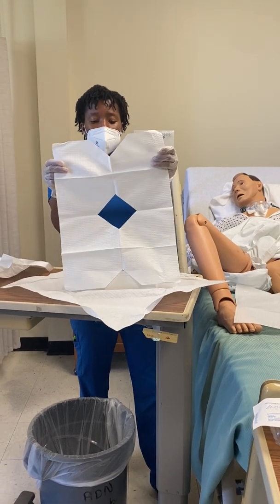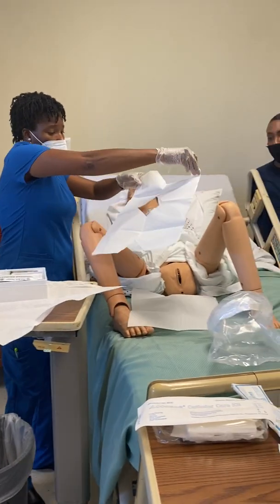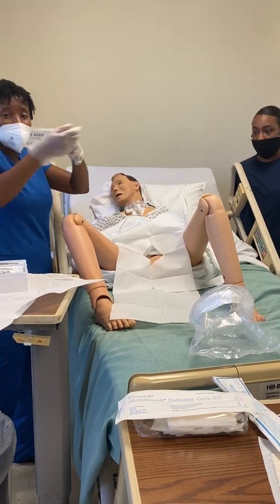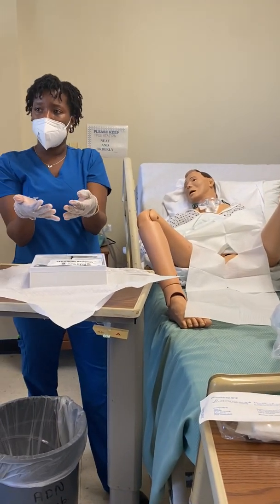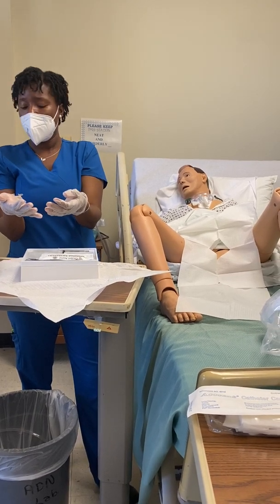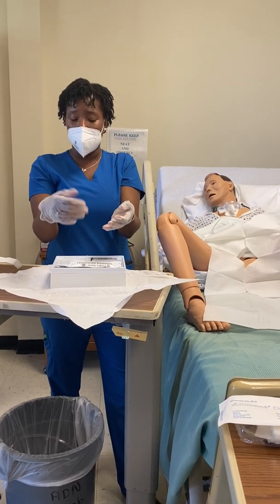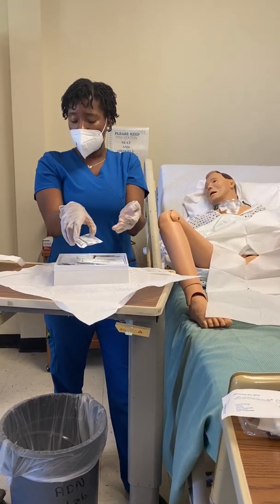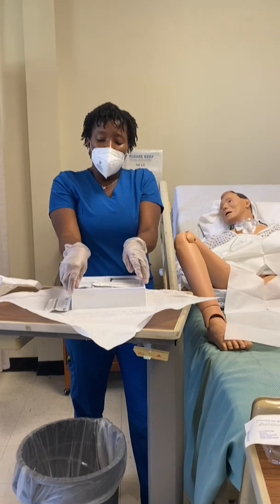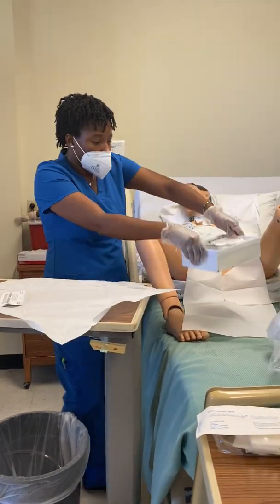Now this is the other drape I was telling you about. So I'm just going to bring it over and I'm just going to drop it. Do I have the right to move it? Yes. But can I move it near the vaginal area? No. Because I don't want to ruin that option of allowing my hands to hit something it shouldn't hit. So I'm going to remove a pack of these. And then everything here is sterile, so I'm just going to take this and move it over. Okay?